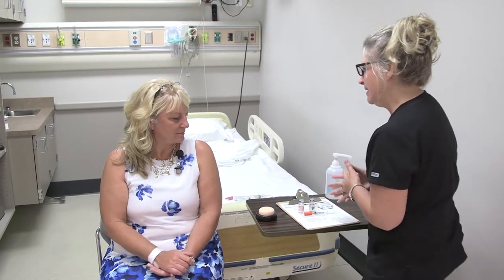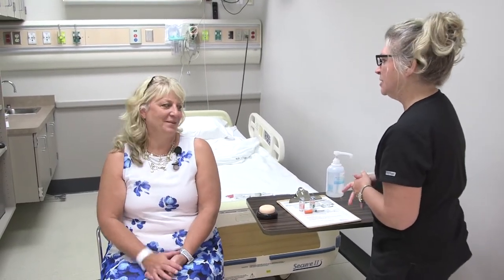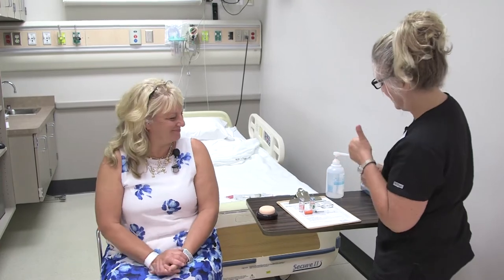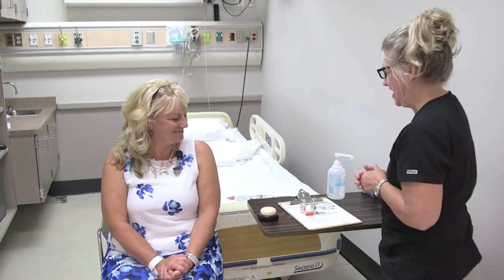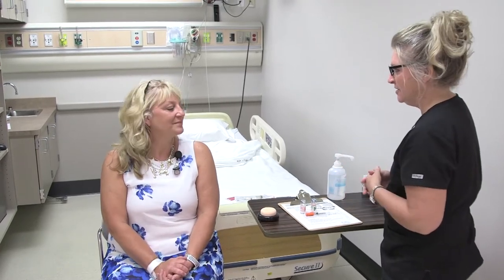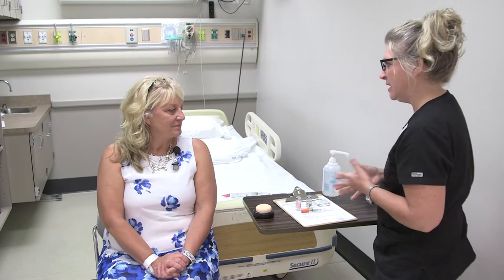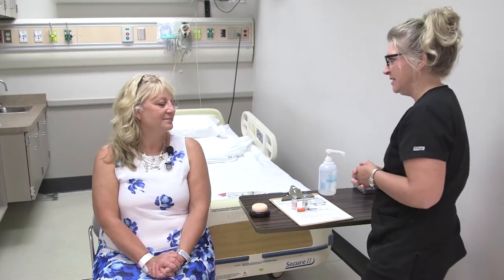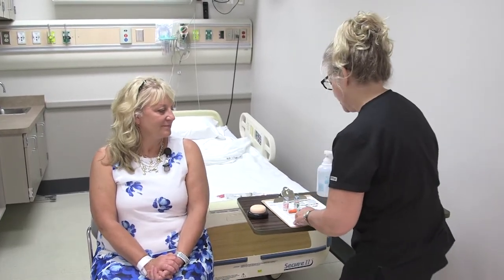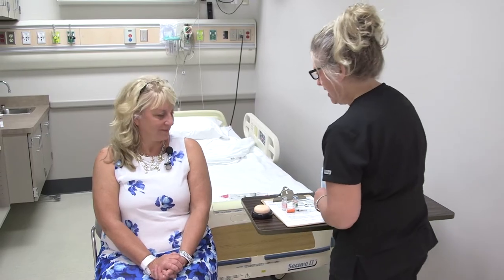Sylvia, have you eaten yet this morning? No. Good. And we checked your blood sugar, so we know what that is and we can go ahead and give our insulin dose as scheduled since your blood sugar was 150 this morning.